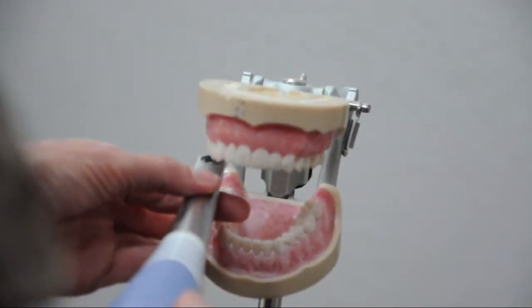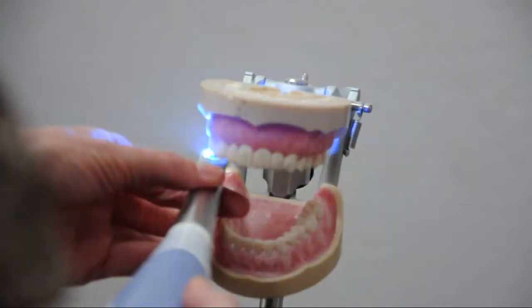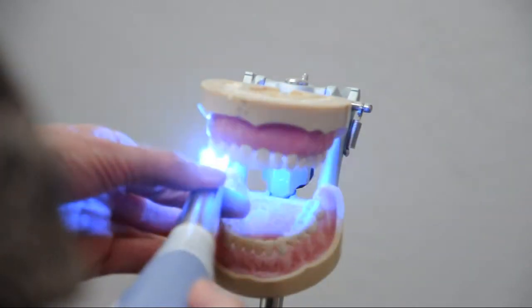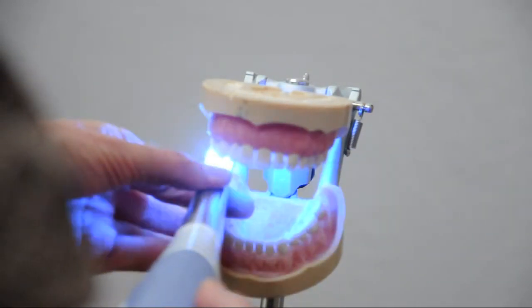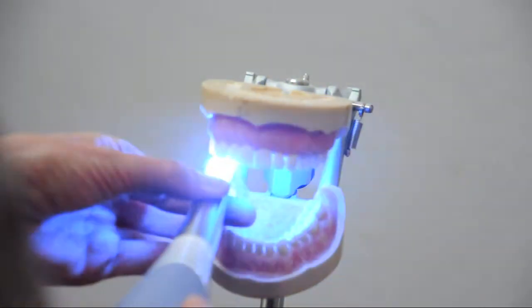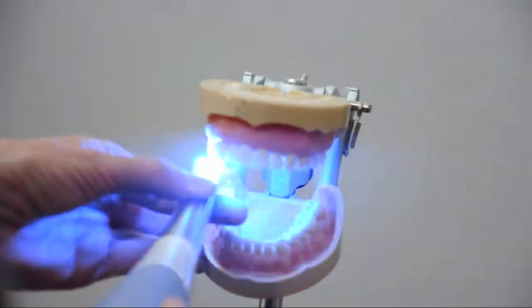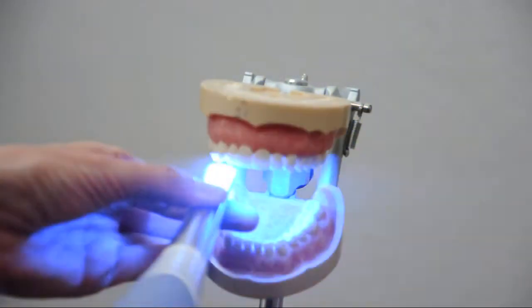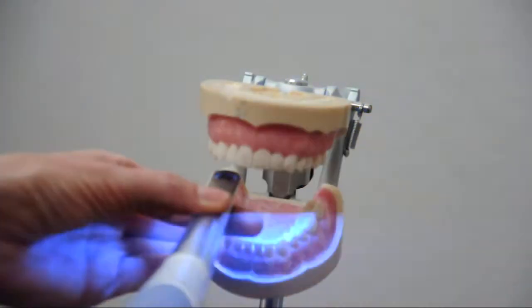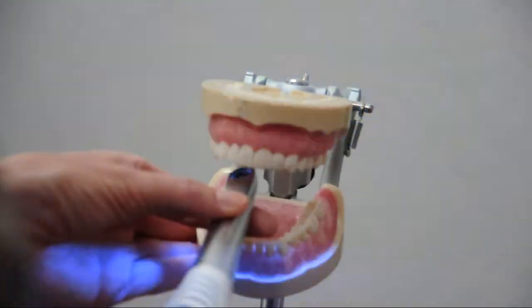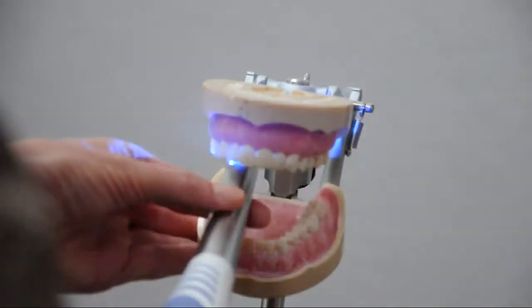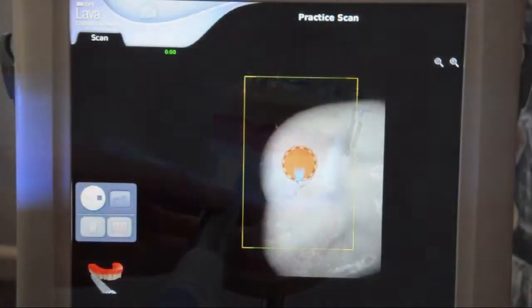You'll just select your opposing arch and begin scanning, doing a quick scan of the opposing arch, just like we did the prepped arch, making again a 3D video image.